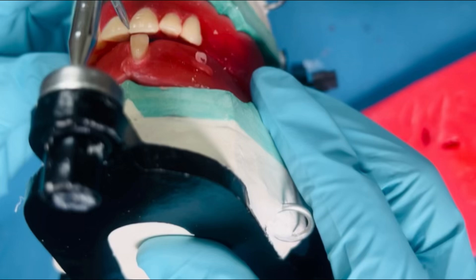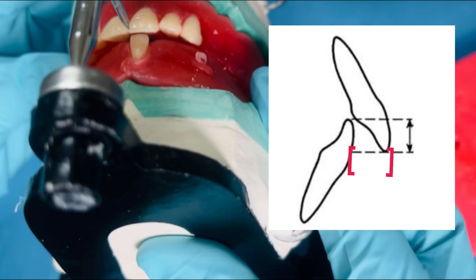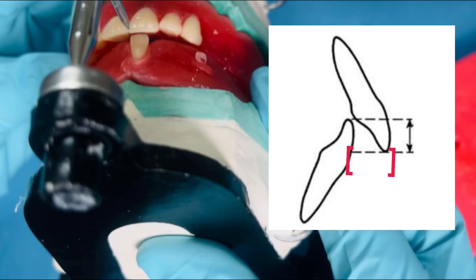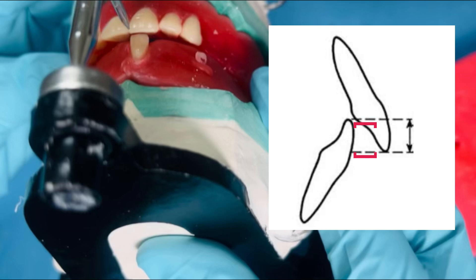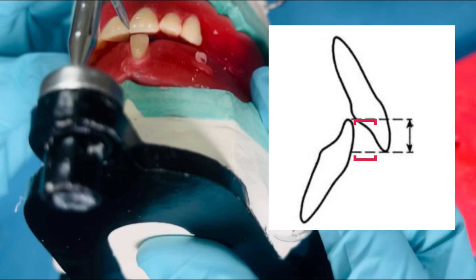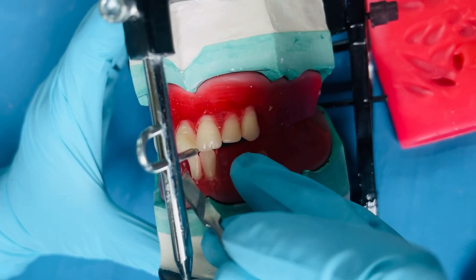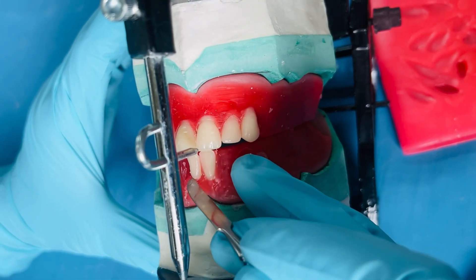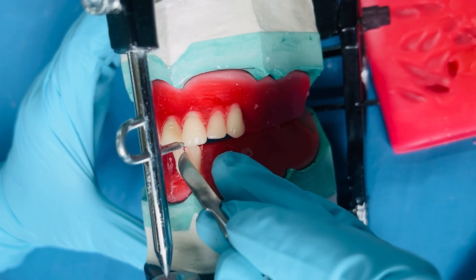Close the articulator and verify if the overjet and overbite are satisfactory. Overjet is the horizontal distance between the incisor edges of maxillary and mandibular teeth, and overbite is the vertical overlap of the maxillary and mandibular teeth. For class 1 teeth arrangement, overjet and overbite can be kept around 1 to 2 millimeters.